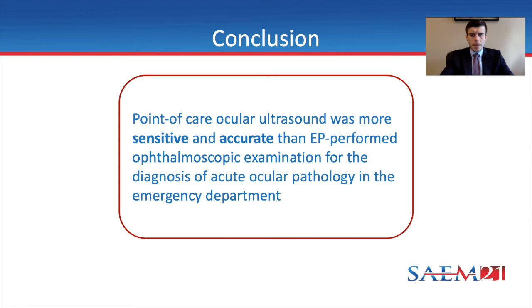In conclusion, based on the results of our study, point-of-care ocular ultrasound was more sensitive and accurate than EP-performed ophthalmoscopic examination for the diagnosis of acute ocular pathology in the emergency department.